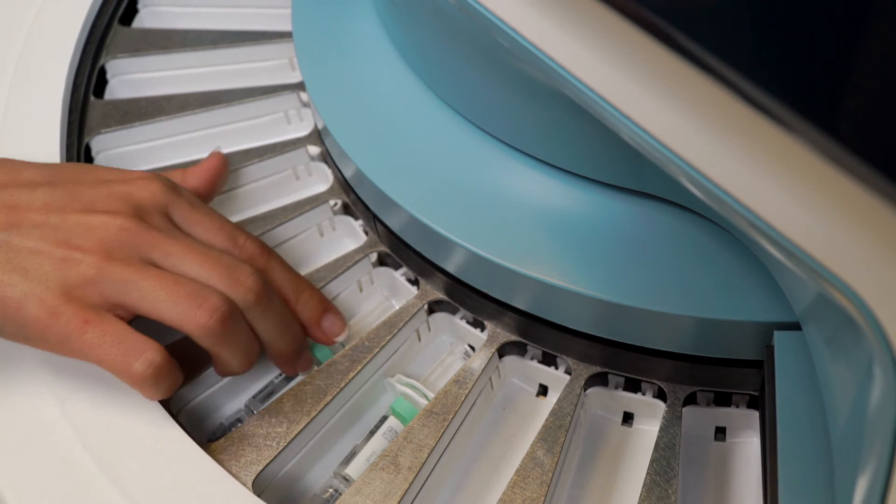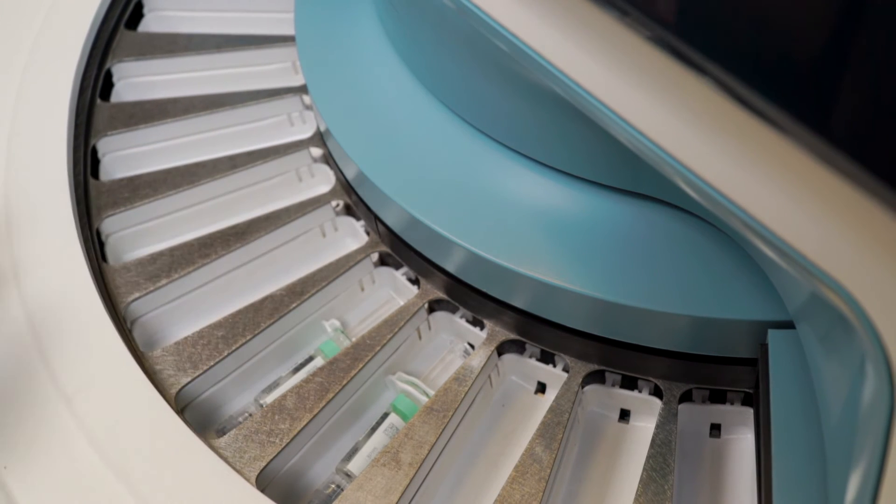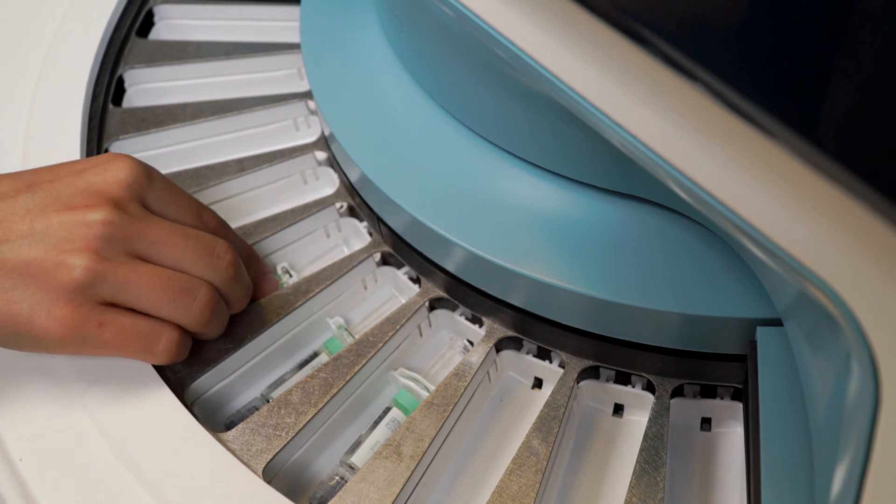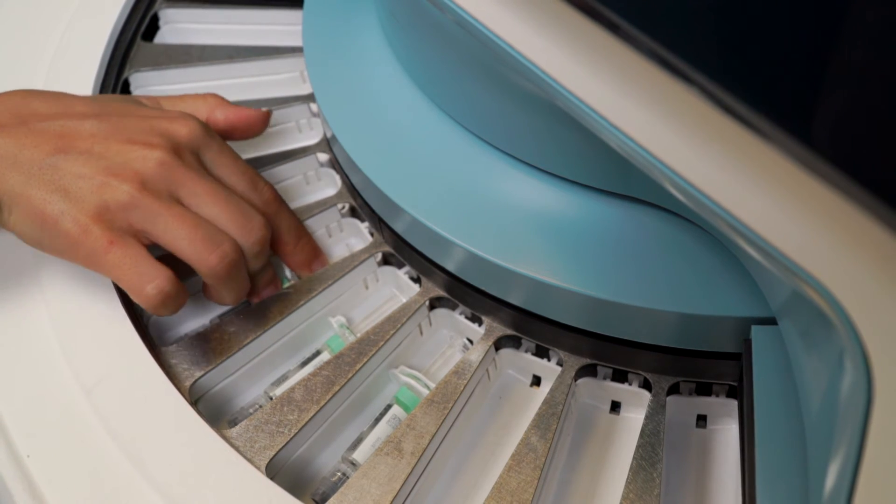When placing a pre-filled syringe, make sure the flange is lying flat. This is easily verified by pressing down with two fingers until you feel it is completely flat.